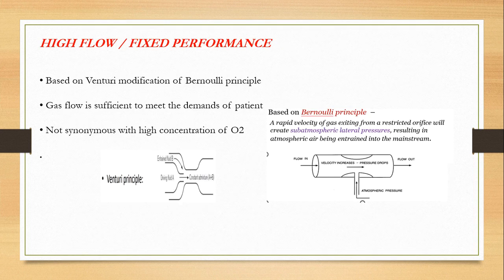Now the high flow or the fixed performance devices. These fixed performance devices basically work on the principle of the Venturi modification of the Bernoulli principle.